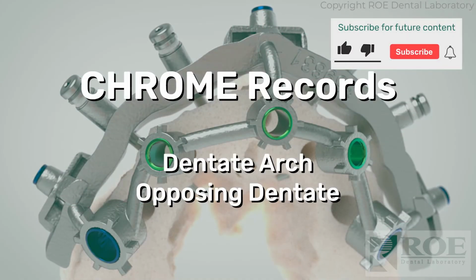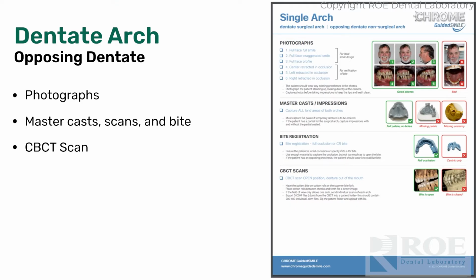This video will explain the Chrome records for a single arch dentate surgery with an opposing dentate arch. As with all of our Chrome surgeries, we offer records for the particular treatment option. In this case, it'll be a single dentate surgery, so the surgery will be just on one arch, but the patient has an opposing natural dentition. So the records are very straightforward.